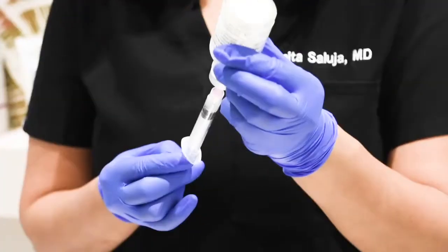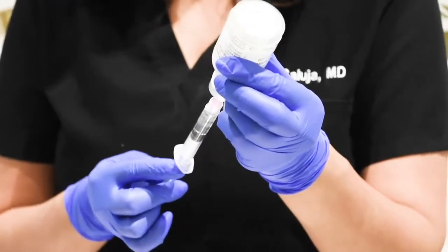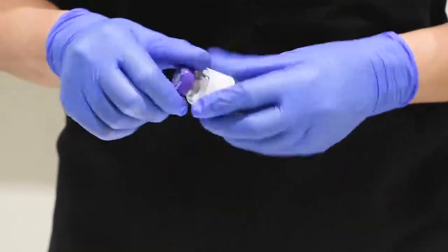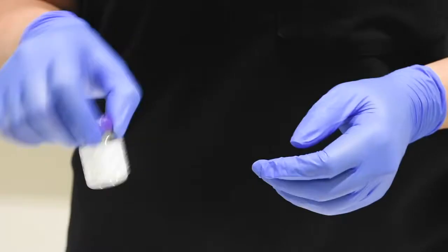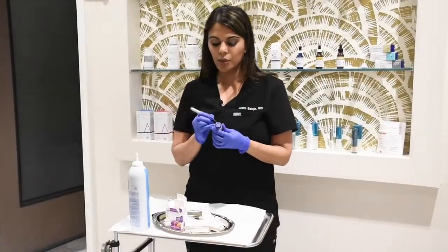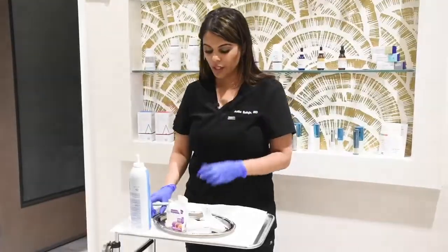We are going to draw up 2.5 ml of saline. The normal saline went into the Botox vial. The Botox powder is now mixed and suspended in saline. We are going to label with today's date and we're ready to use.